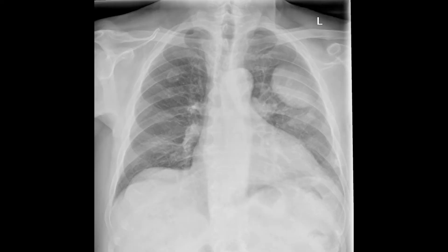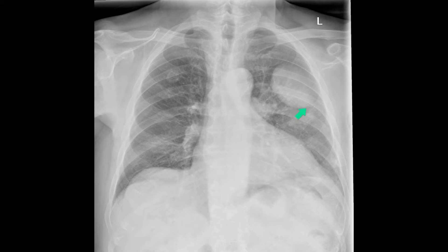The incomplete border sign. In this chest radiograph, you can see that there is a lesion projected over the left mid-zone, which has a sharp medial border, and this medial border, as it goes more laterally, becomes indistinct. In other words, it fades as it goes laterally.